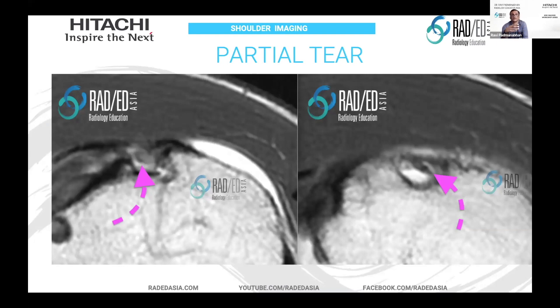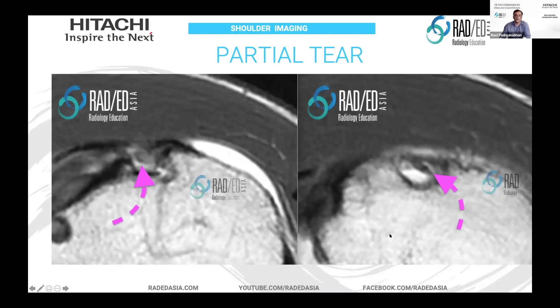In the previous case the tendon was okay in size and the signal was within the tendon. Here we've got a tendon that's actually really small and thin in size. There's increased signal within it and there's probably some degeneration of the residual tendon fibers. You would describe this as severe thinning of this extra-articular portion of the biceps tendon, in keeping with partial tearing or severe partial tearing.